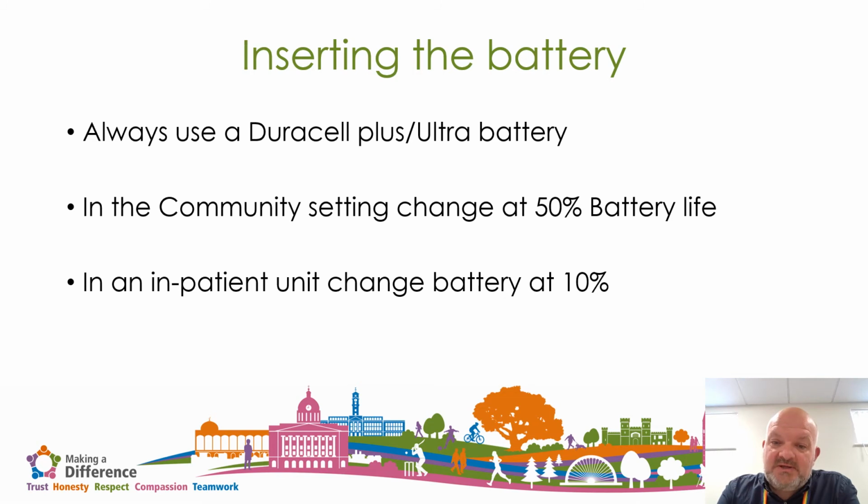Obviously in an inpatient unit where the battery is being checked every 4 hours, it can be left to go down more than that, else there'll be a huge amount of wastage. So in an inpatient unit we should be changing the battery when it reaches 10%.